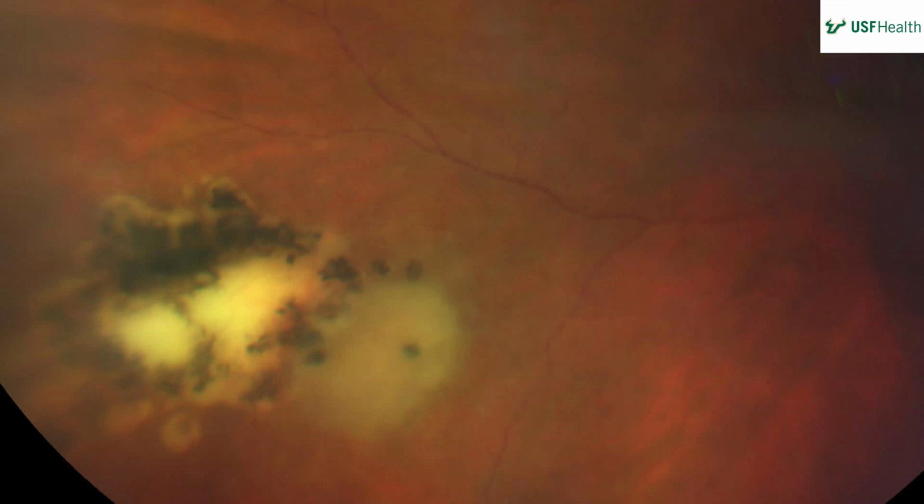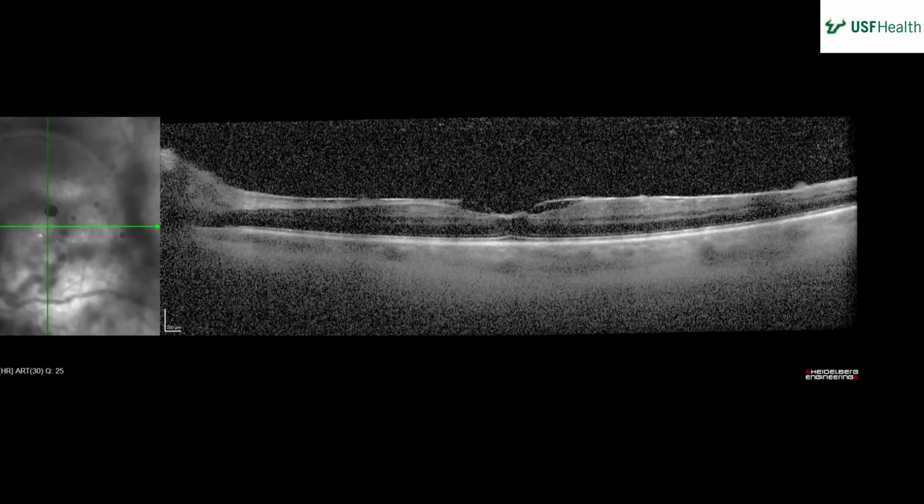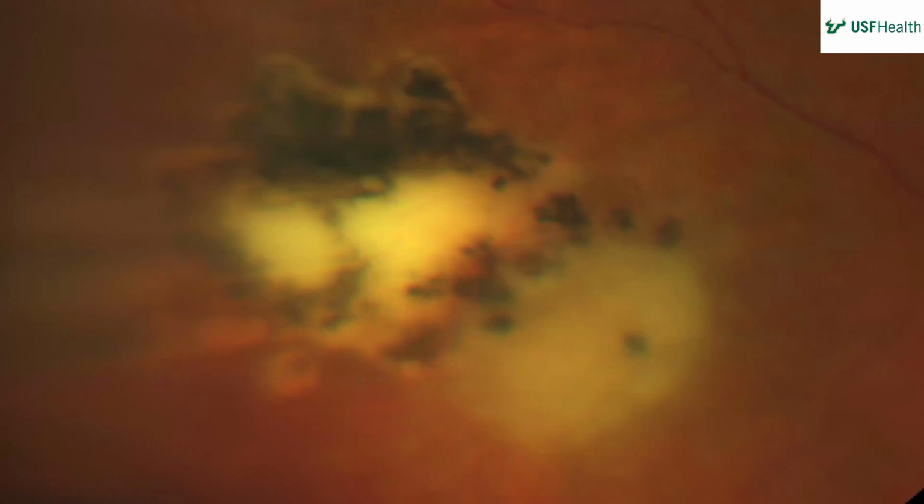So it's sort of scarring. Pigment in the eye almost always means chronicity, like around a detachment, or if you have a nevus with pigment, pigment's generally a chronic thing. I think we have one more magnified view. And then you start seeing the cells. Yeah, so kind of showing the same lesion. Oh yeah, same lesion there, but it looks like a little bit more hazy picture of it.